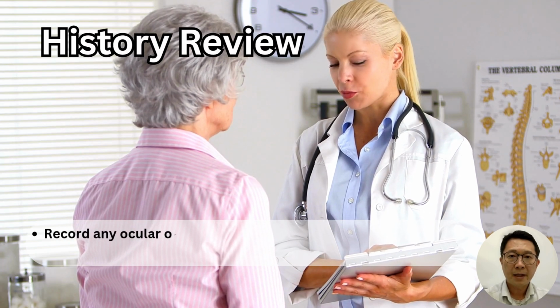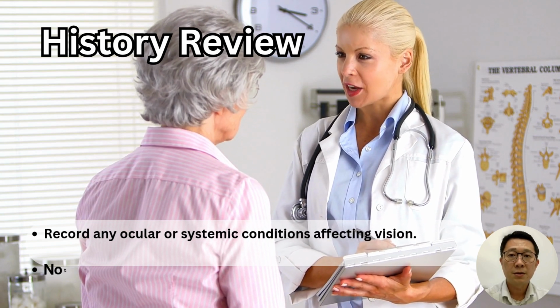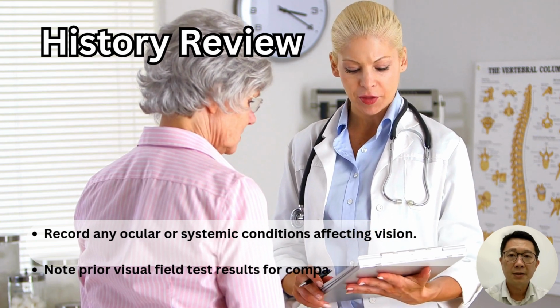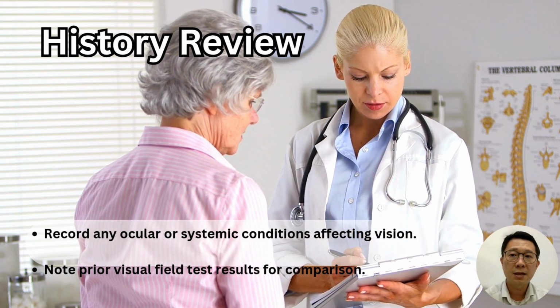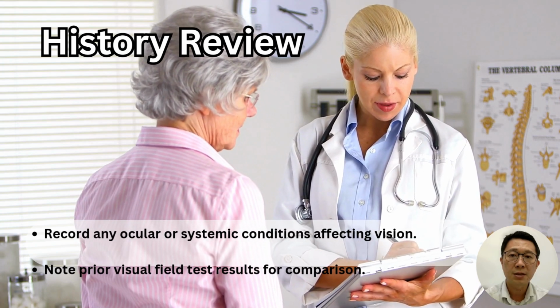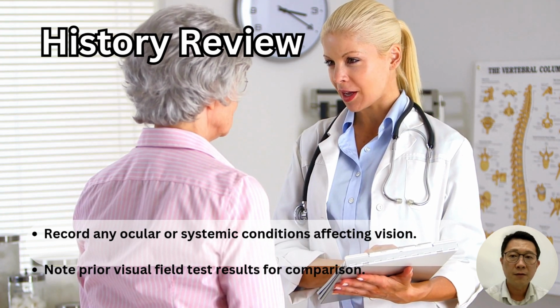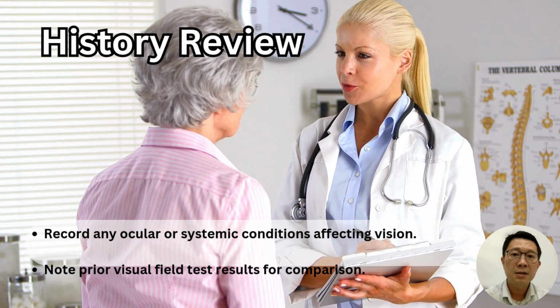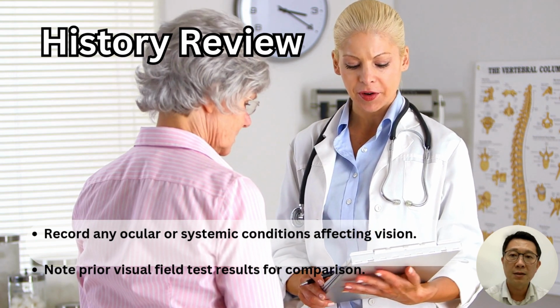Gathering relevant background information from the patient is very important. This includes recording any ocular conditions such as glaucoma, cataract, or retinal disease, as well as systemic conditions like diabetes or neurological disorders that may affect vision. In addition, reviewing and noting any previous visual field test results allows for direct comparison with the current findings.